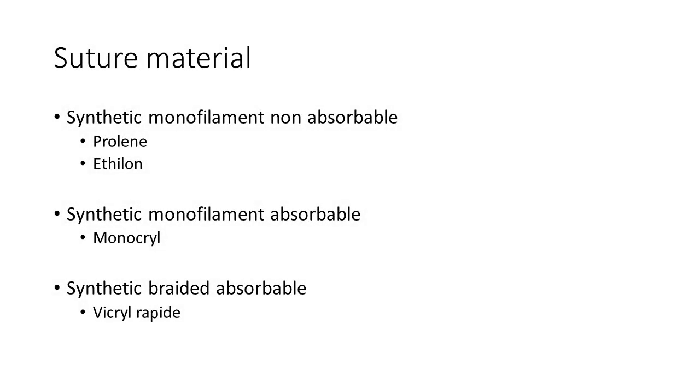Moving on to suture materials, virtually all of the materials that we use now are synthetic materials, and most of the sutures that you would use in the trauma setting or accident emergency setting will be monofilament. That is to say, smooth like a piece of fishing line.